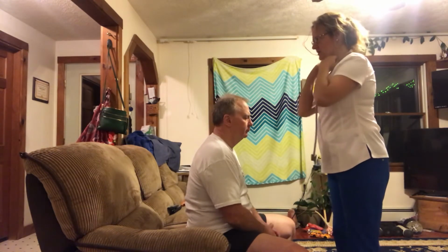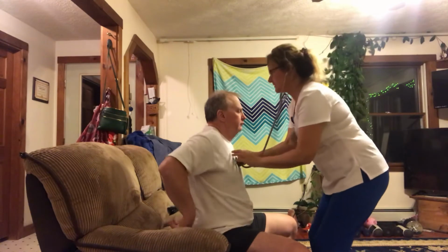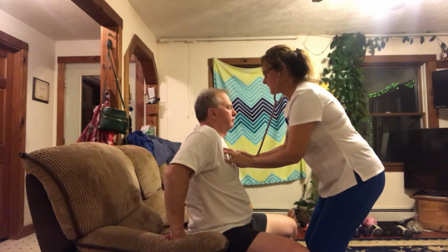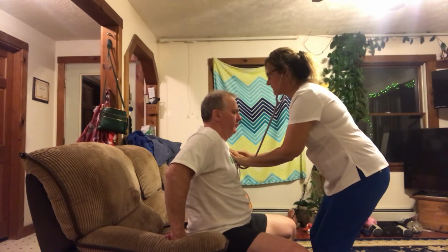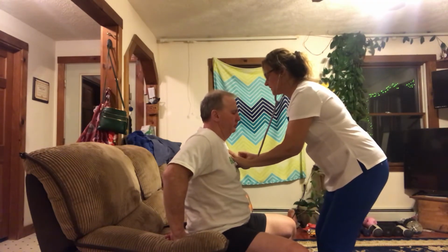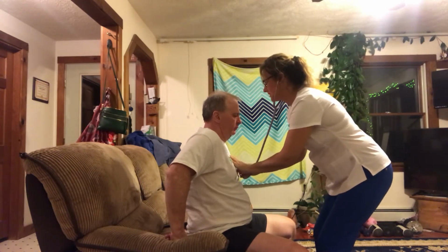And now, we'll start off with your aortic, second intercostal on the right. Take a deep breath. And then your pulmonic, second intercostal on the left. Erb's point, third intercostal on the left.